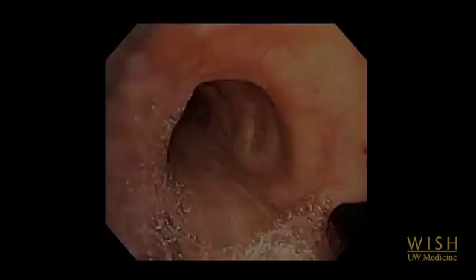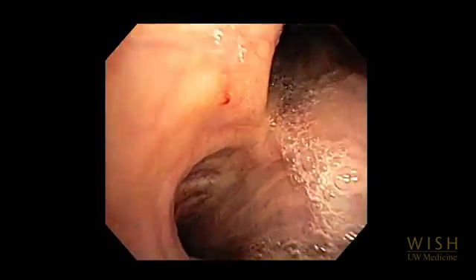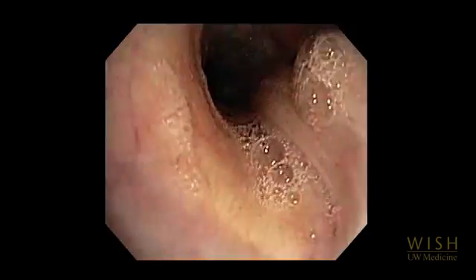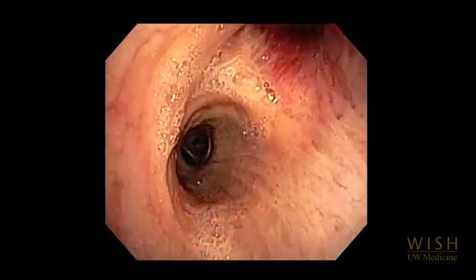After completing full inspection of one lung, return to the main carina to begin inspection of the other. The bronchoscope is entering the right main stem. The distance from the main carina to the right upper lobe bronchus is shorter than from the main carina to the left upper lobe bronchus.